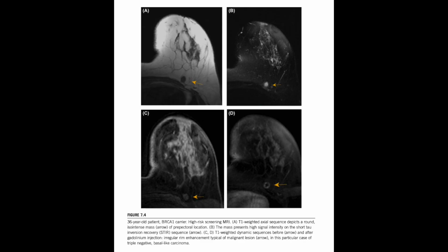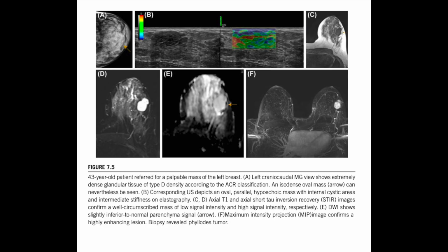And that rapid in and out gives us that classic worrisome curve? That's the one, the washout curve. We call it type 3 kinetics. You see a really fast initial uptake, more than 100% increase in signal, followed by a significant drop, a washout, in that later phase. And the benign lesions? Benign lesions, like our fibroadenoma, are usually supplied by normal, well-formed capillaries, so that tissue acts more like a tightly woven cloth. So it absorbs slowly. It absorbs slowly and holds on. That gives us persistent curves, or type 1 kinetics. Slow initial uptake, usually under 50%, with this steady, persistent enhancement over time.